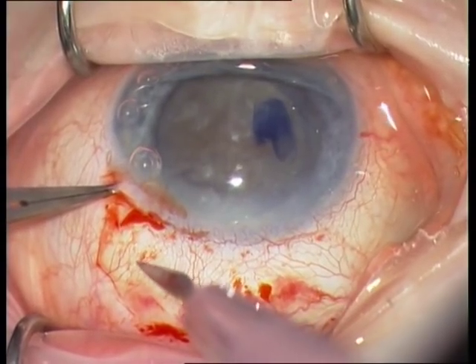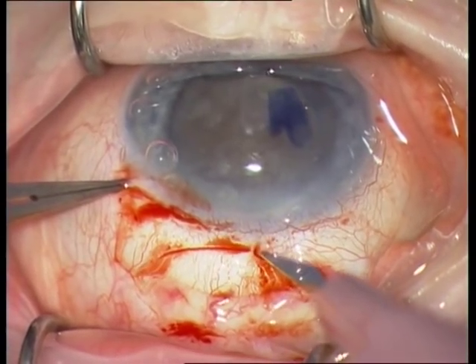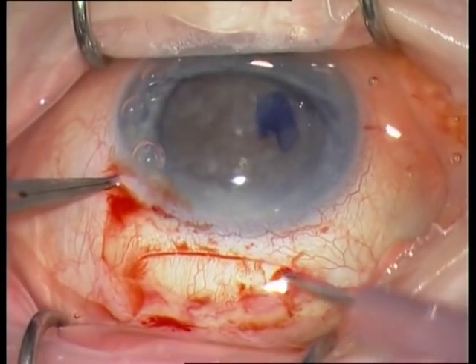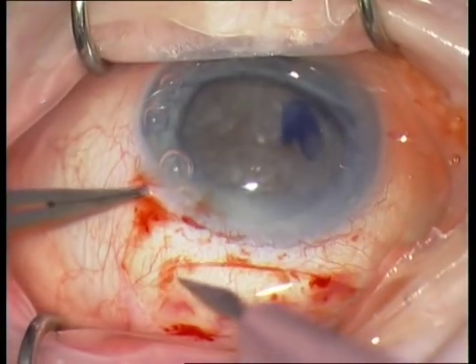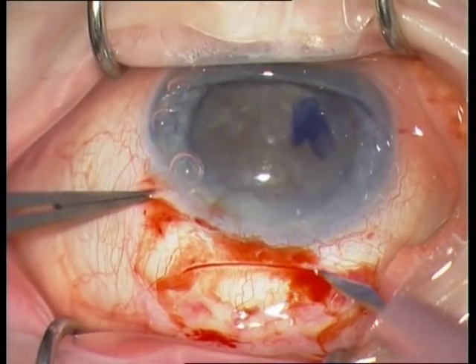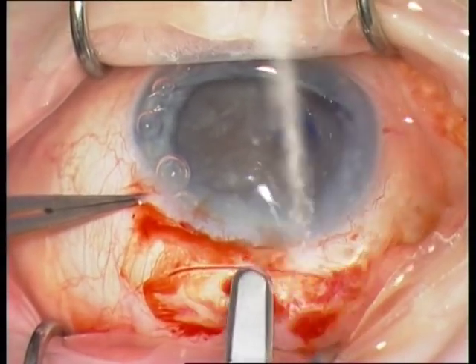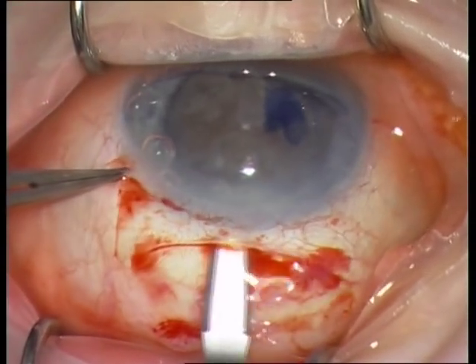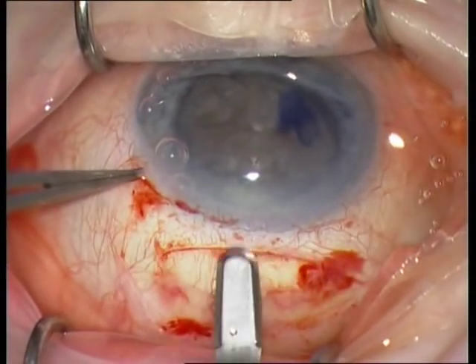The next step is the scleral incision. I am using a 15-degree knife and making an 8 mm broad frown incision. The next step is the dissection of the scleral flap with a bevel-up crescent knife.